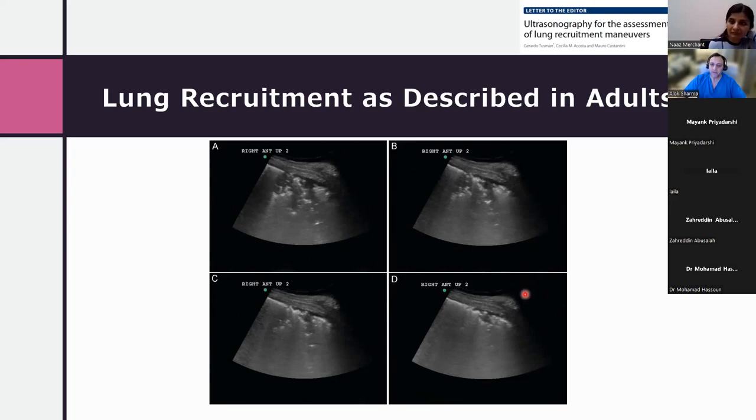And really, those are babies who are big in term. And often what you find is we're ventilating on pressures of 28 over 5, 5.5, and actually increasing a PEEP from 5 to 7, maybe 8, to achieve a recruitment maneuver is something that you can do in a controlled manner, maybe over a period of, say, my bravery would be about maybe 10 minutes, 15 minutes.